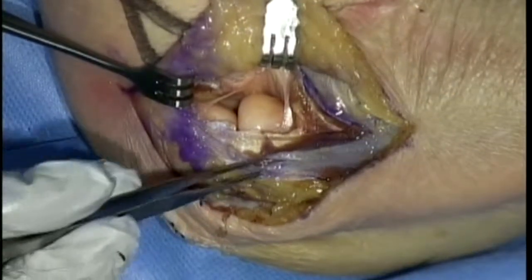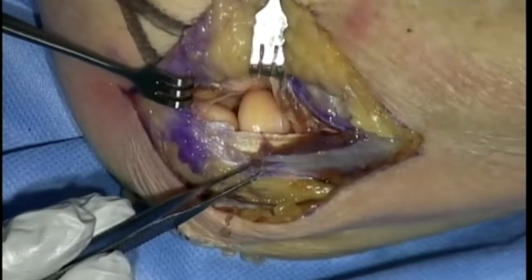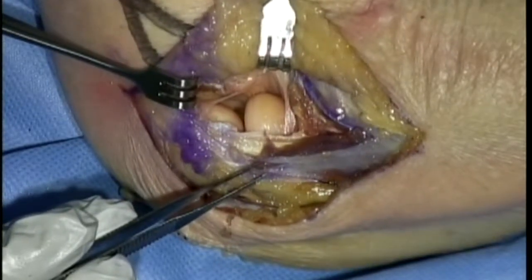Can you tell them about how to put a plate on that? So that'd be a thing to explore this afternoon. So yeah, we're going to do that with the forearm exposure. And if we're going to plate it, we want to plate it in the neutral zone, in the safe zone.